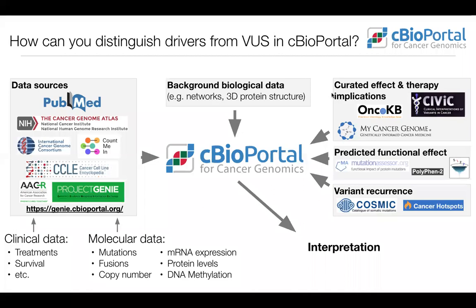We've added annotation sources into cBioPortal to make driver vs. passenger interpretation easier, divided into three groups. First, curated data about specific known mutations — we use three sources: OncoKB (maintained by Memorial Sloan Kettering), CIVIC (Washington University in St. Louis), and My Cancer Genome (Vanderbilt University). These tell you whether a mutation is a driver or likely driver. We also have predicted functional effects from Mutation Assessor, PolyPhen, and SIFT. And sometimes the most powerful signal is recurrence — we rely on COSMIC and Cancer Hotspots (cancerhotspots.org) for information about recurrence at the amino acid level.